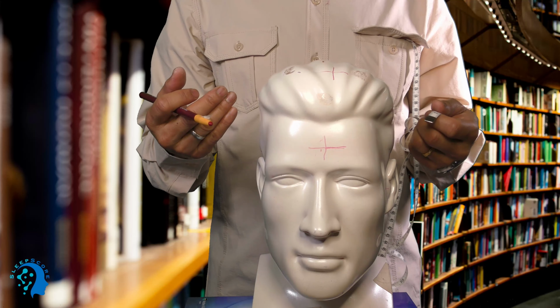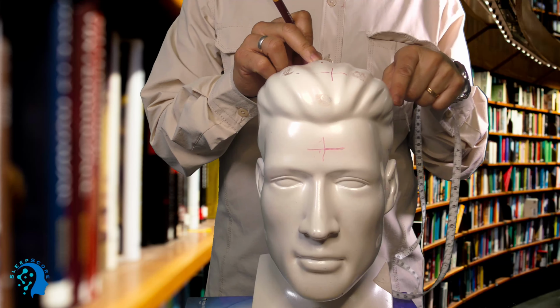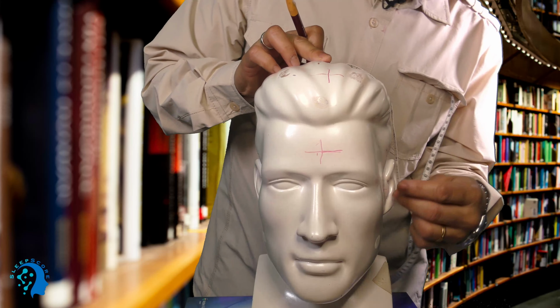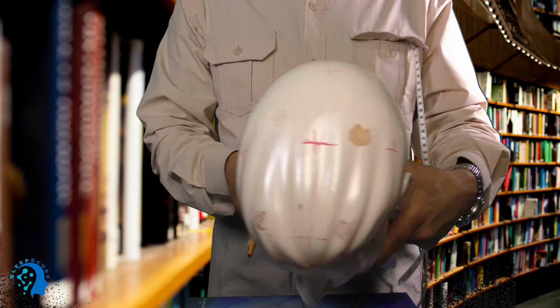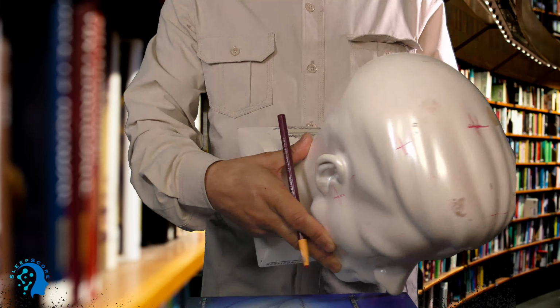So what I do, from the center point, I go either side, okay? So from here, down here, I go 7.2 right here. Okay, this is my 7.2. And I go on this side also, 7.2. So the easiest way is going this way. Okay, this is my 7.2. All right, so if I show you, this is center, on this side 7.2, this side 7.2, okay, 7.2. So in that way, I got 3 of my points.